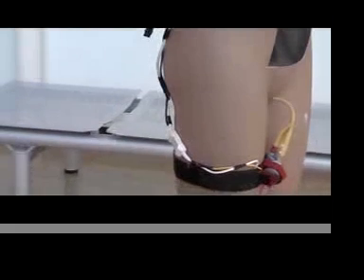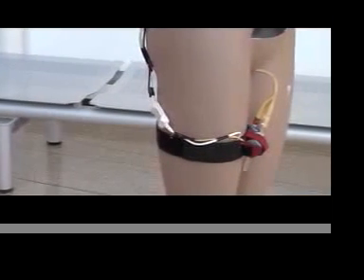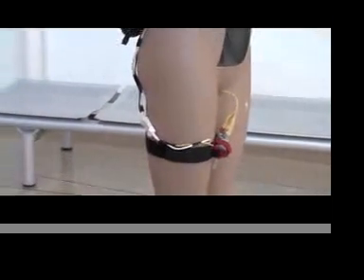Our device incorporates a three-way Foley catheter and consists of two main components: a belt-mounted user interface housing the internal circuitry and a lithium polymer battery, which is connected to a thigh strap containing a pressure sensor to measure the intra-bladder pressure, which relates to bladder volume, and a compact solenoid valve, which is used to control the flow.